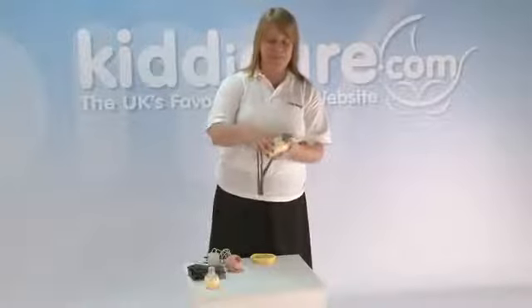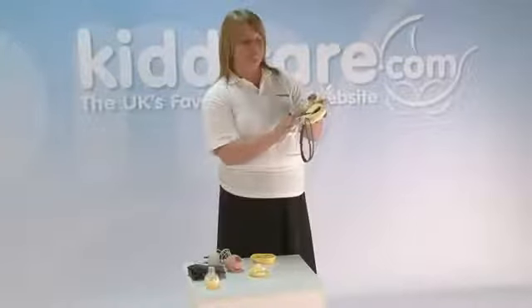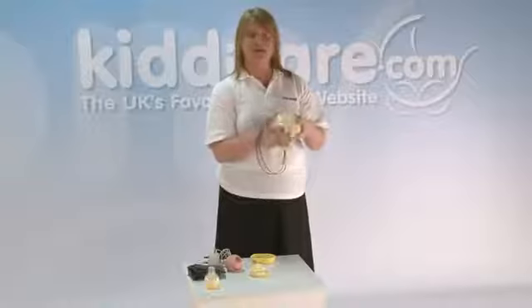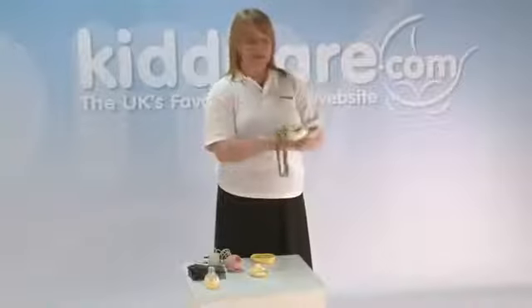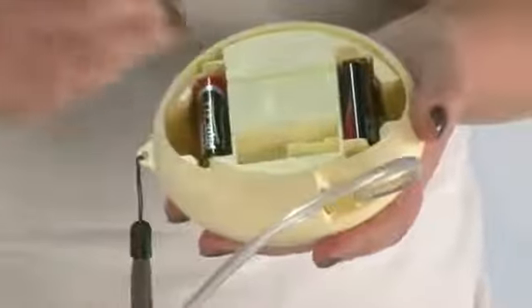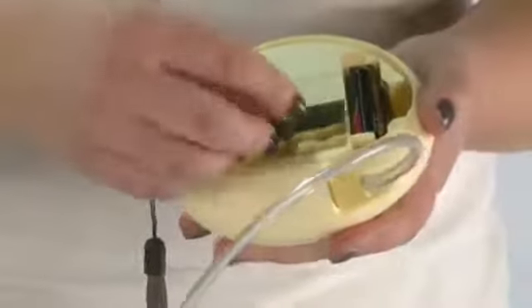In the back of here, in the battery pack, you'll notice there's a small sponge where the tubing enters the pack. So what you would do, you would turn the pump on and turn the vacuum up nice and high and run the pump so that anything in the tubing is drawn into the sponge there. When you've done that, take the sponge out, wash it thoroughly, make sure it's dry, and then pop it back in.